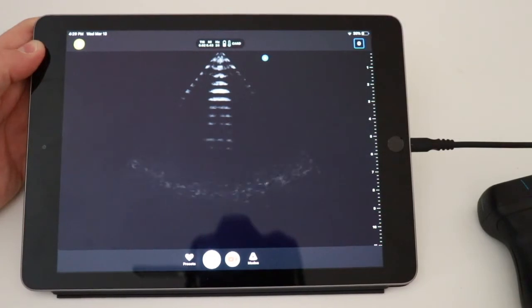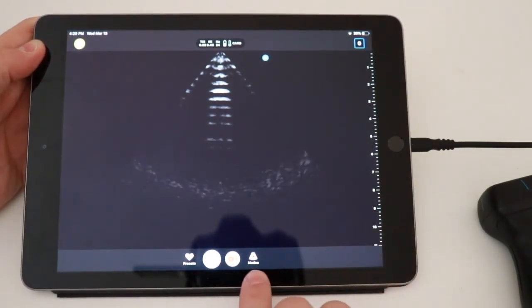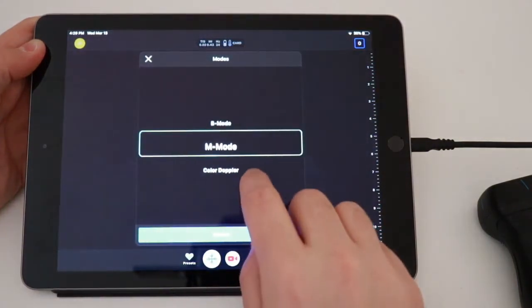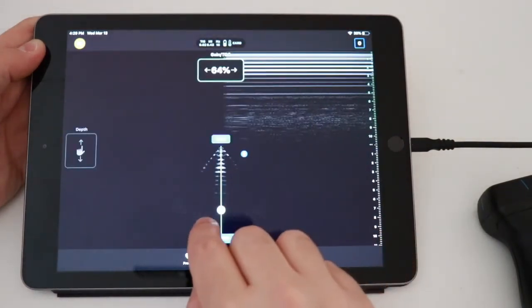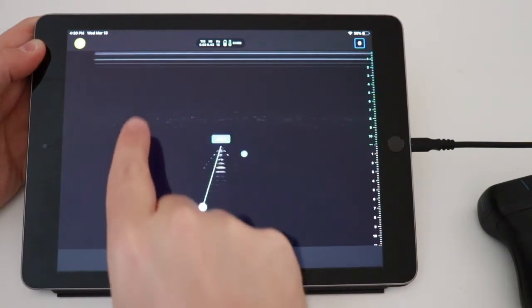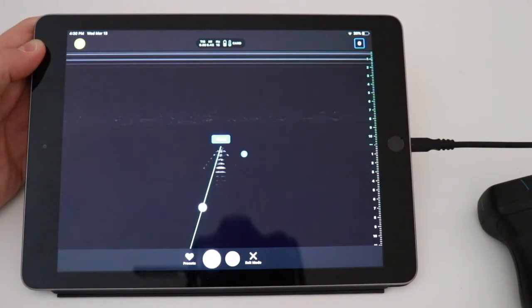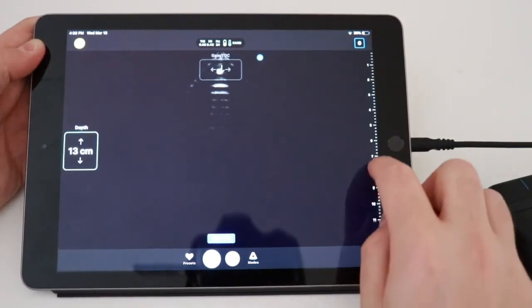We talked about a couple of different modes like M mode before. If I want to go to M mode, I'm going to hit this button over here. That's my modes. And just like we did before, we're going to click on M mode. We're going to move this line over with time. And again, my y-axis is the depth. My x-axis is time in M mode. If I want to go back to my regular 2D mode, I hit this. And again, we're in cardiac mode.